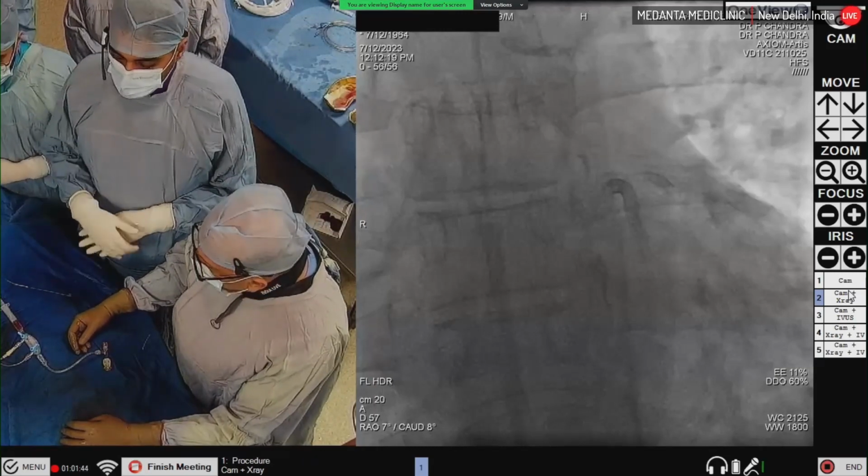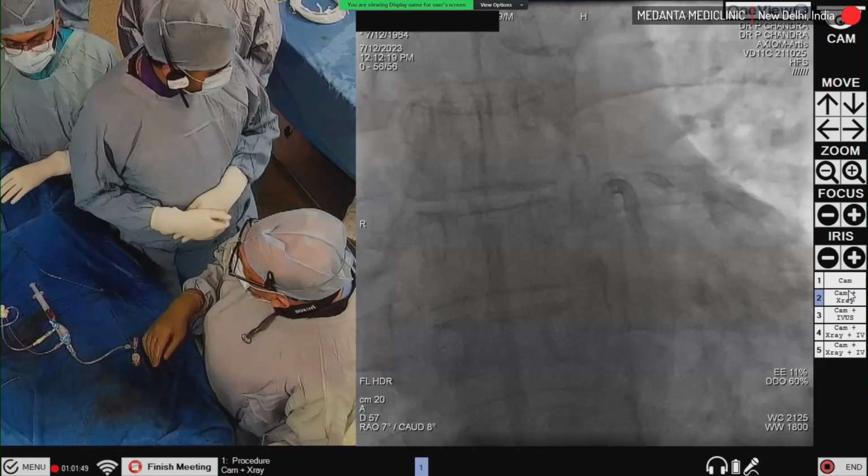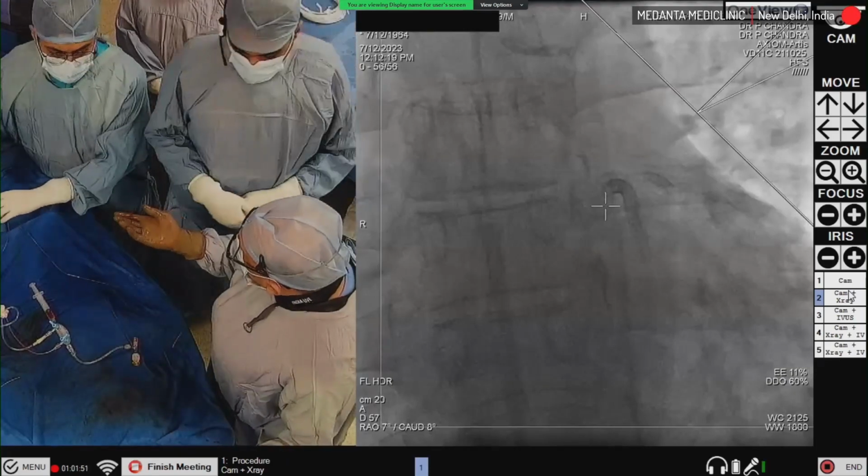Okay. We have to check in 2 or 3 more views. So we checked in 2 views. Everything is okay. We can stop. So with this, I think we can stop here.